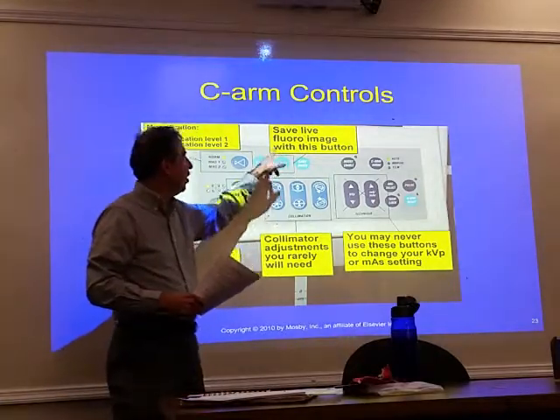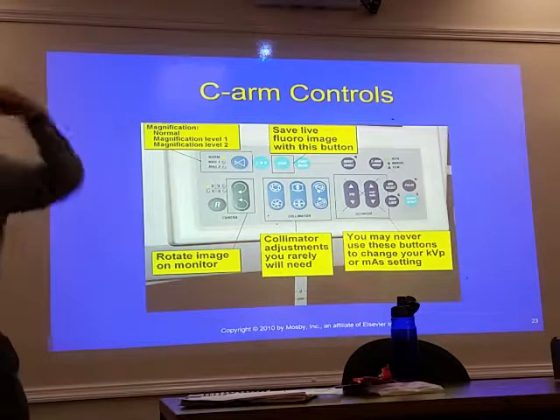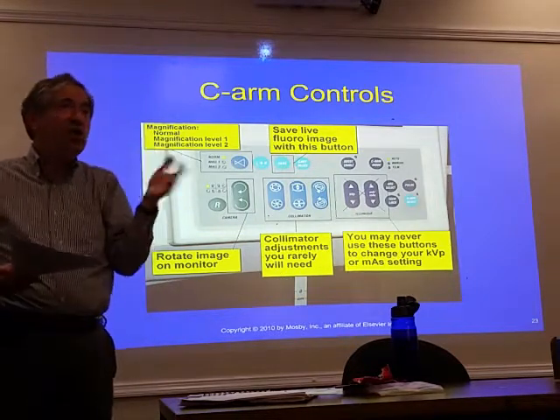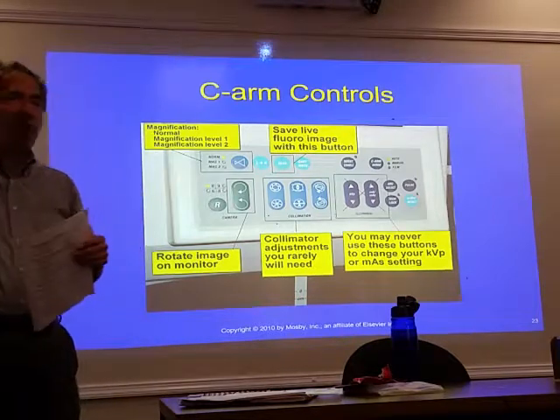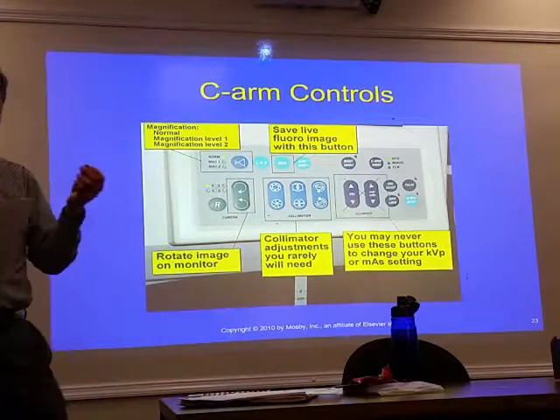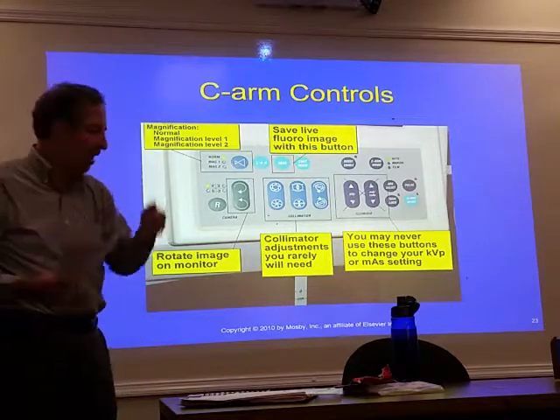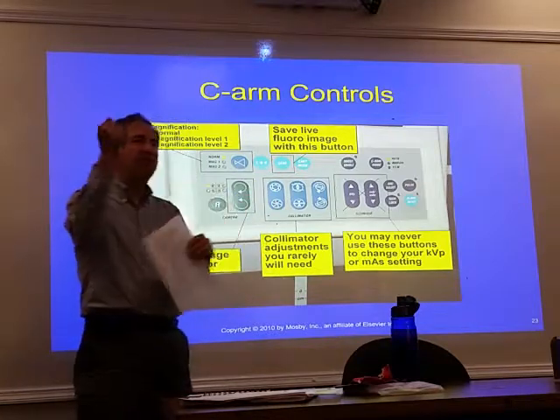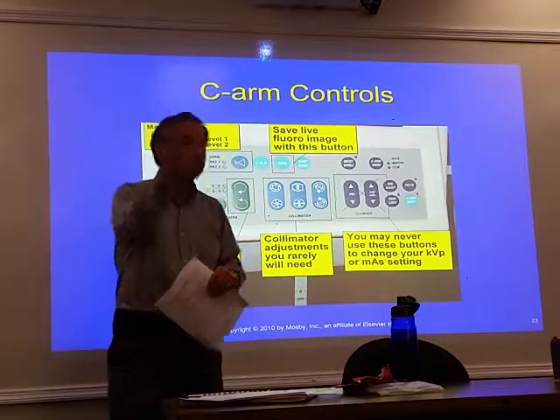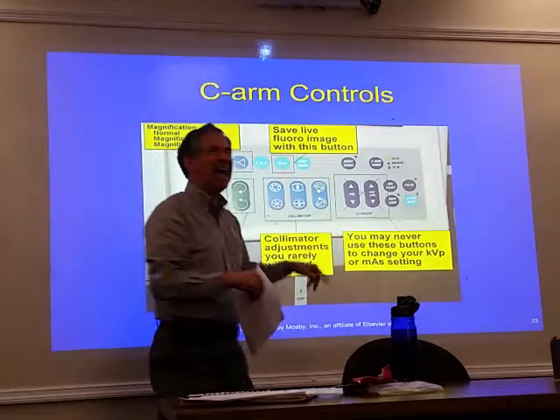The save button here. Bob was telling me that a lot of the units will automatically save, but just make sure, if it is something where you're actually in control, they don't use the foot pedal, and it isn't saving it, one of the better things to do is on your control panel there. You can go ahead and save some images, like the doctor says, oh, that's a good image, go ahead and hit the save. And a lot of times on the screen it'll say save.